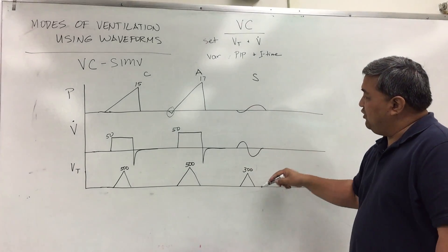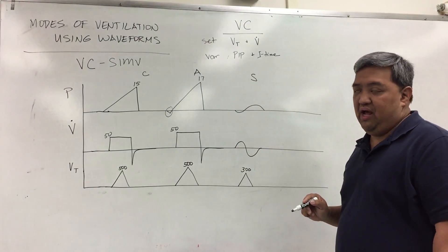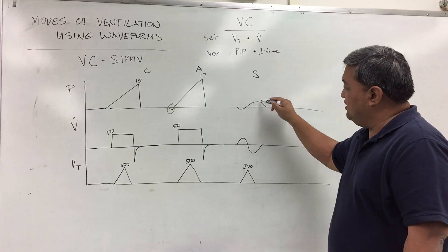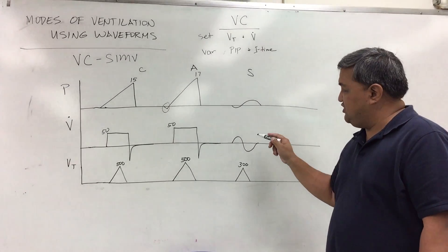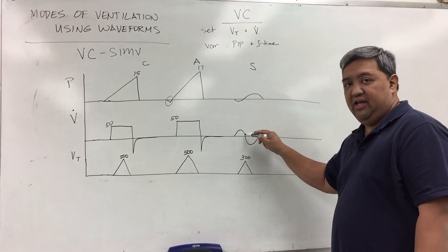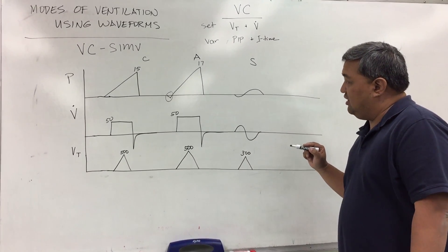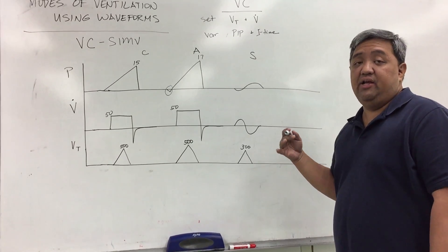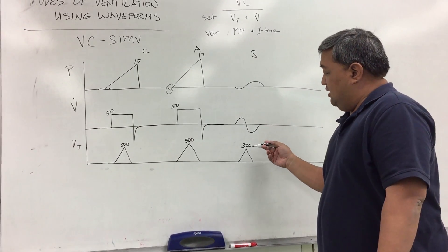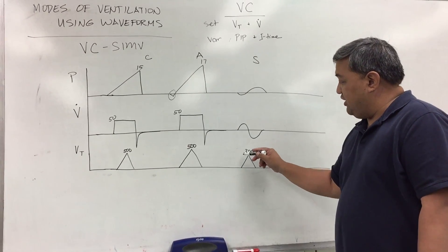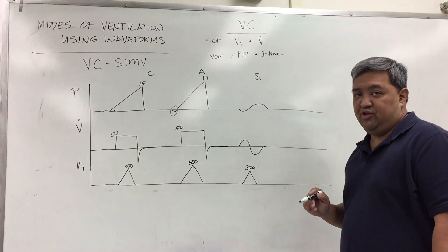On our third breath, it is a spontaneous breath. Here you see the negative pressure being generated by the patient and then positive on exhalation. The opposite for the flow, positive flow on inhalation and negative on exhalation. And then given a tidal volume depending on the deep breath or shallow breath that the patient's taking. So here I gave an example of 300 mL.